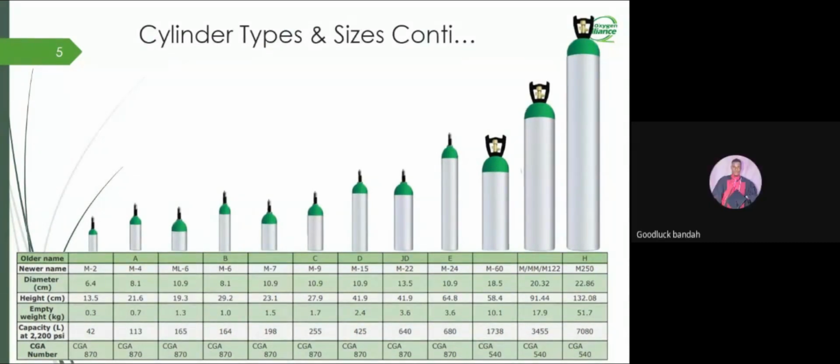All right. So I just want to come back to Bernard's question, which was asking about the material. When we were talking about the types of cylinders, we had those cylinders that are made of carbon fibers. So one of the materials that can be used is carbon fibers.